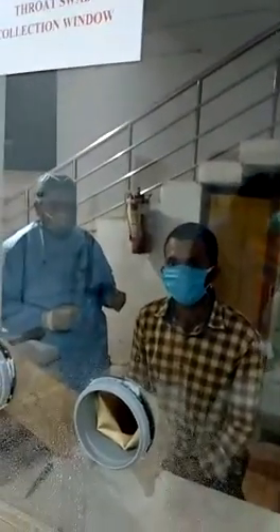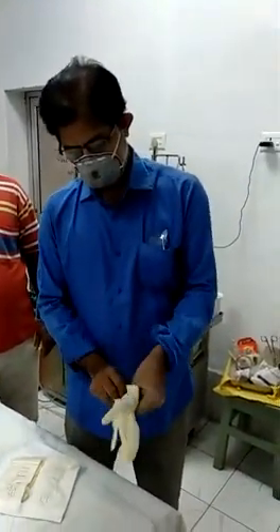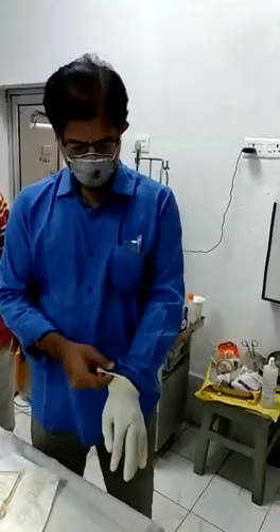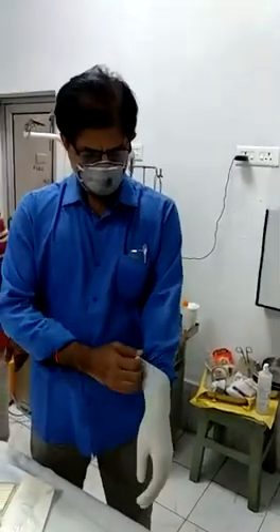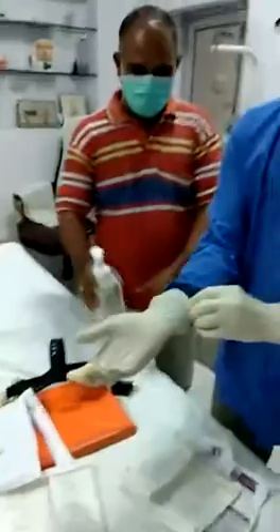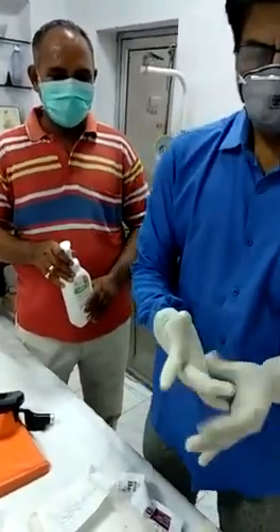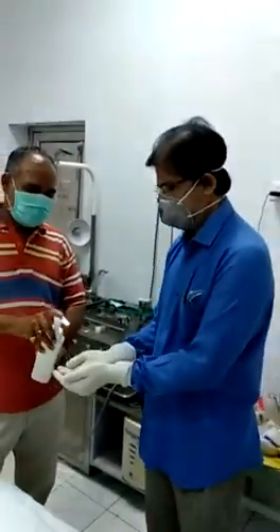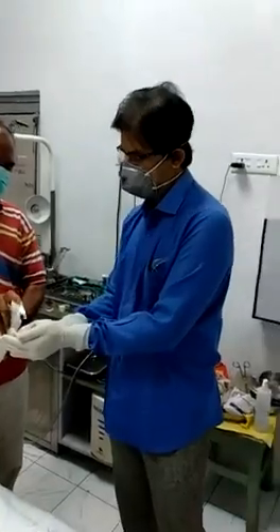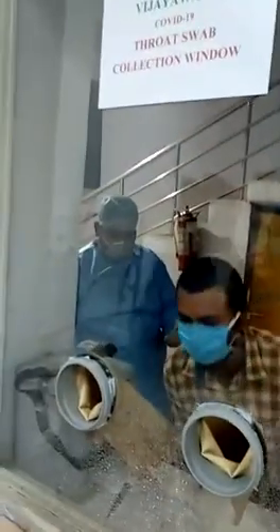This is the second case for which the sampling will be taken by Dr. Ravikant again. It is getting ready and almost ready. Sanitizing the hands with sanitizer. The patient is also ready. It has been sprayed another time.